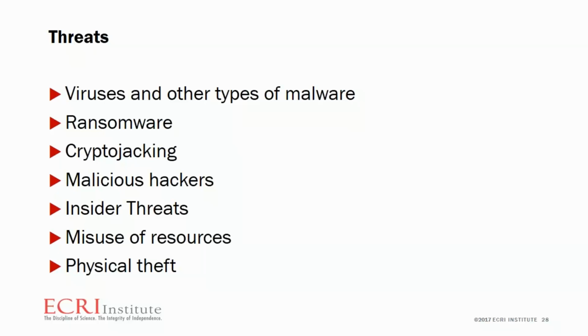So now that you have an idea of the vulnerabilities, you can determine what can happen as a result. The NIST guidance SP 800-30 describes a lot of these in detail, but this slide highlights a few that are relevant to healthcare, including viruses and malware, ransomware, of course. Cryptojacking is getting more prevalent.